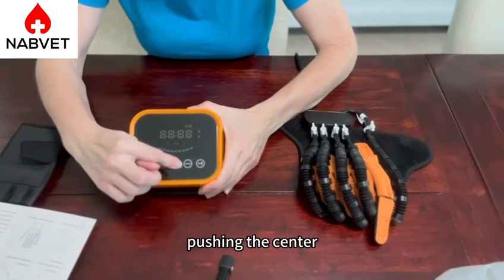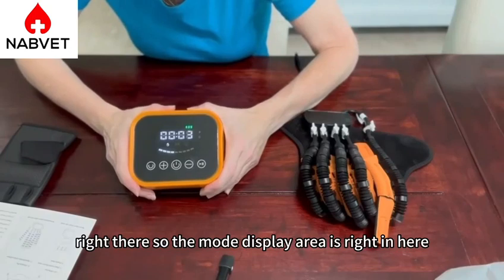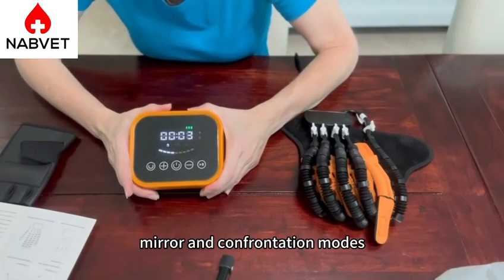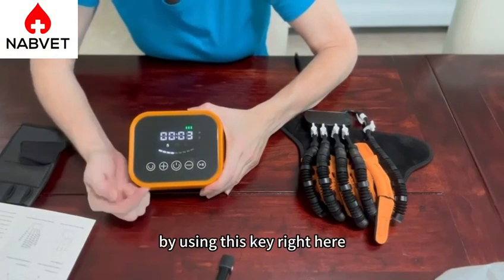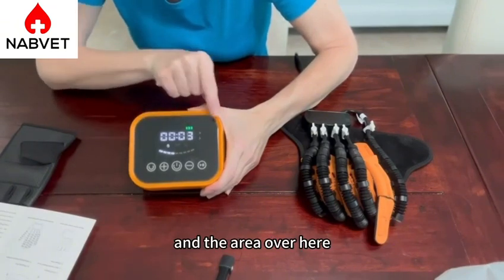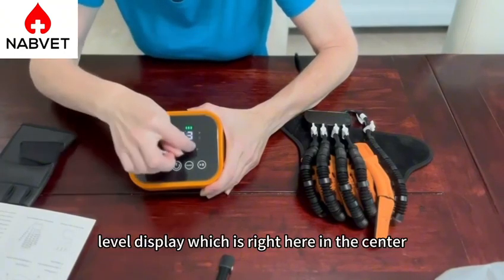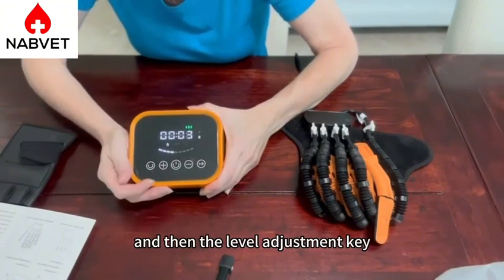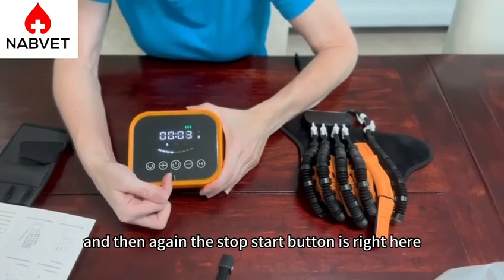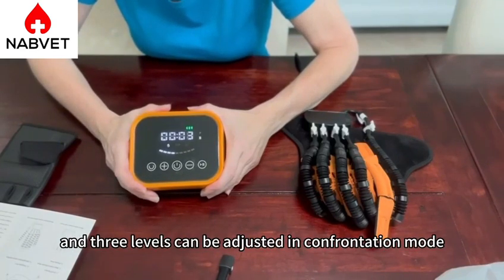I just turn it on by pushing the center button, and then I'm going to go ahead and pause it right there. The mode display area is right here, and that's going to include the automatic mirror and confrontation modes, which is changed by using this key right here. We have the battery status up at the top, and the area over here will tell you if it's paused or if it's in running mode. We'll have the level display right here in the center, and then the level adjustment key — the plus is to increase it by one and the minus is to decrease it by one. The stop-start button is right here. There is a total of nine levels that can be adjusted in automatic mode, and three levels can be adjusted in confrontation mode.